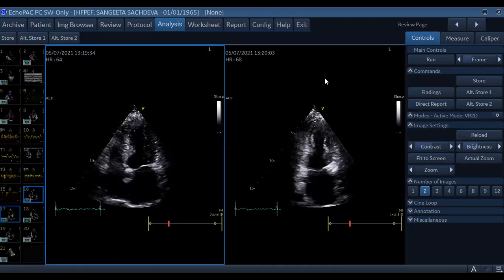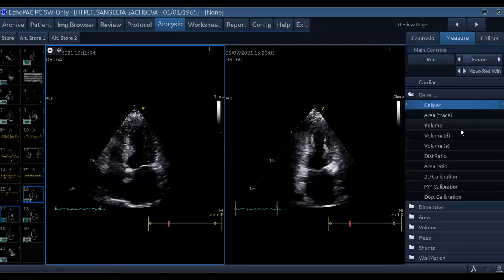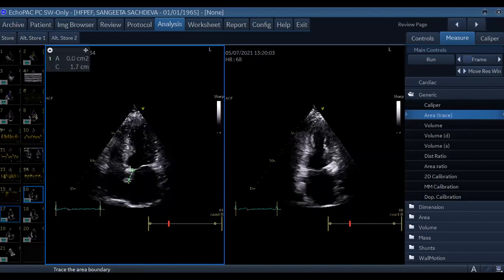And in ECG, what is the end systole? End of T wave. End of T wave, yes, sir. Correct. So we are at the end of T wave. Now I've got both 4-chamber LA and 2-chamber LA, right? Now I'm going to trace their areas one by one. I'm going to start with the medial annulus, and go along with this medial annulus.